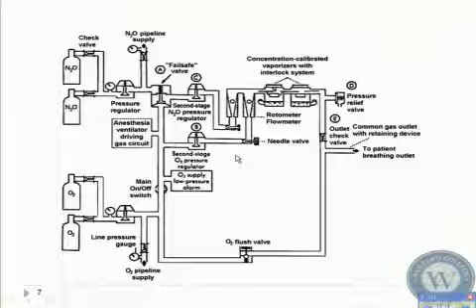So as you turn your flow meter up, if you turned it up to 15, which is wide open, that psi is not going to really hurt a patient. All right. But if you were running it at 50 psi, that can cause problems. If you're running at 2200, you just blew your whole patient up. I mean, literally, their chest would probably explode. So anyway, these pressure regulators serve to drop the PSI down to acceptable levels so you don't get a lot of turbulent flow that goes on.